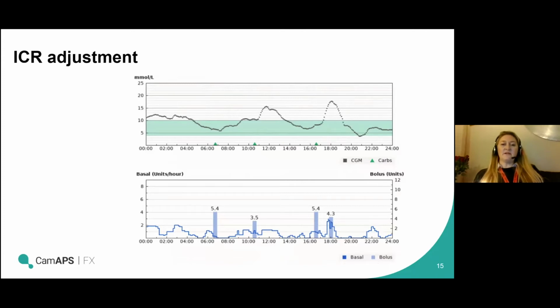So you're never just going to look at one day by day and think, okay, definitely if I can see this today, I'm going to definitely need to make changes. You're going to want to flick through a number of days in that period that you were looking at and just ensure that, yeah, that is the pattern. It does seem to be what's going on here.